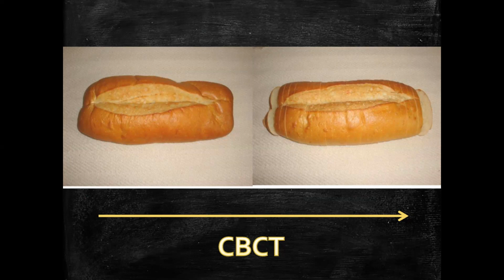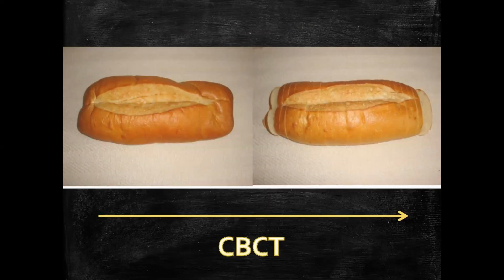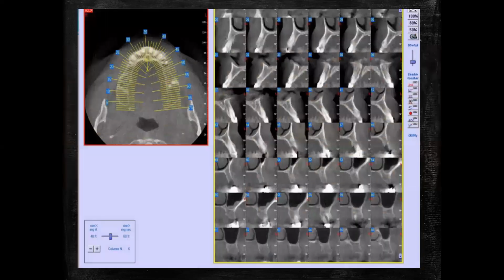Piling up slices into a volume, versus cutting the volume into slices, gives fewer chances of error in CBCT compared to the CT scan. As I told you, the entire volume is sliced into a number of slices, which we give to you in our radiology reports.